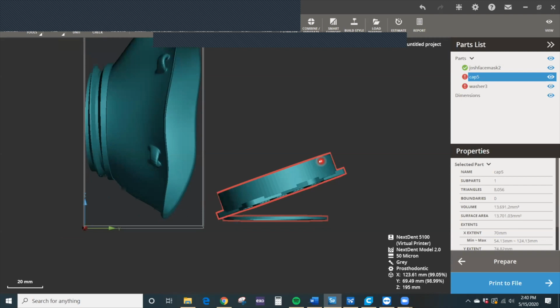Some may be more sensitive than others, but even if I have a flat object, I like to provide an incline of about 20 degrees. The reason is it builds up with less adhesive forces. So maybe, even for dental applications, you've noticed that a lot of your models are dropping off. They're falling into the resin container during the print process.